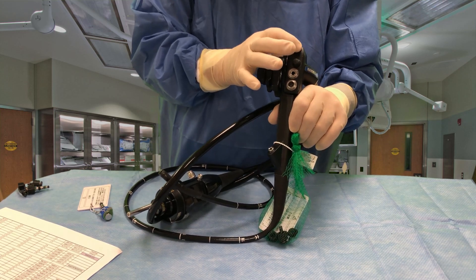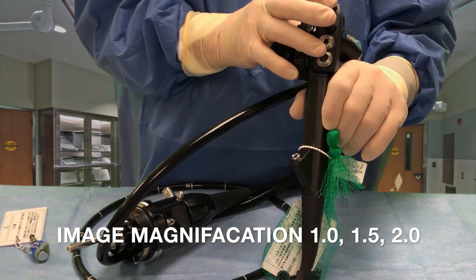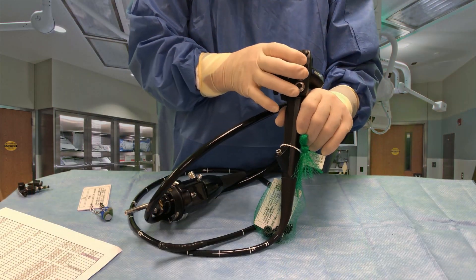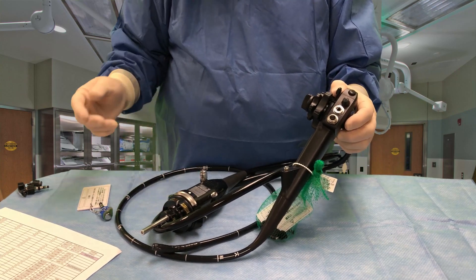This next button, button number two, is used for magnification — either 1.0, 1.5, or 2.0 in magnification. And this big button right above where the valves go in is for a still frame.